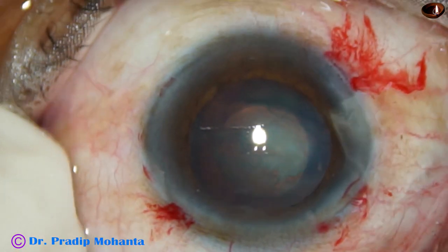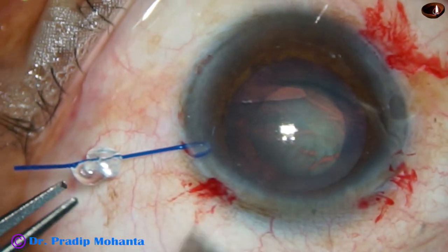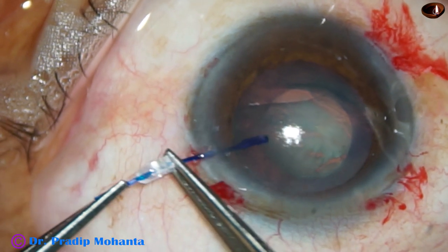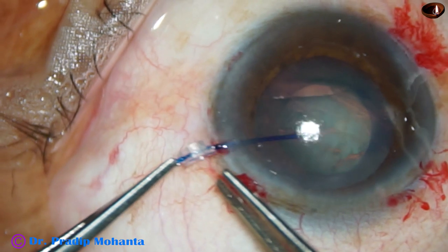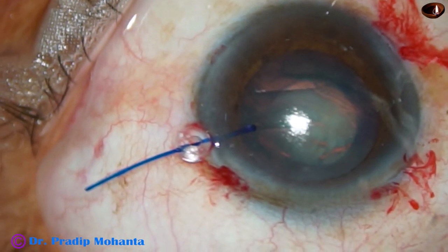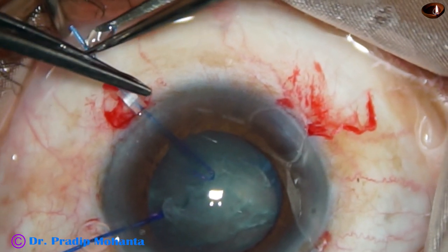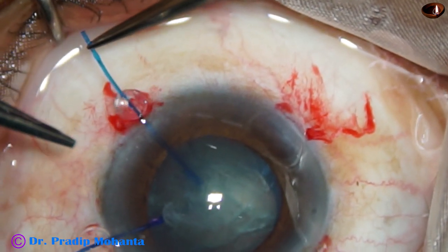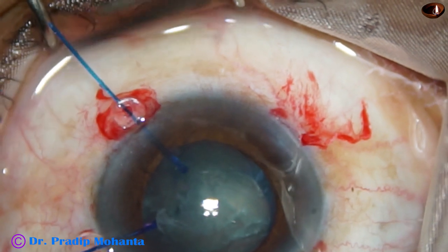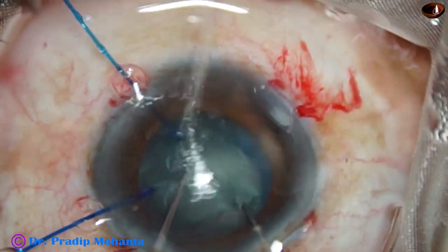The CTR has gone into the capsular bag very nicely. Now I inject some more viscoelastic and apply two iris hooks — the first one at around 2 o'clock, which has hooked the rhexis margin, and another hook at 4 o'clock, which also has hooked the rhexis margin. So we have got support by CTR as well as by the iris hooks.